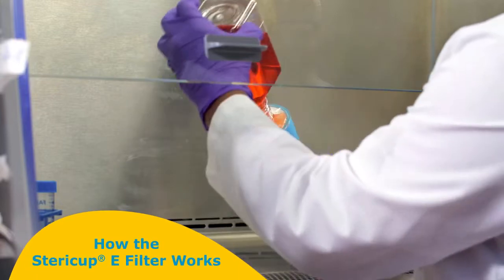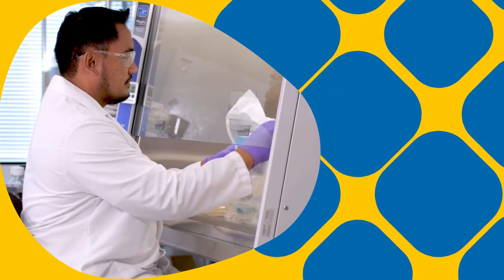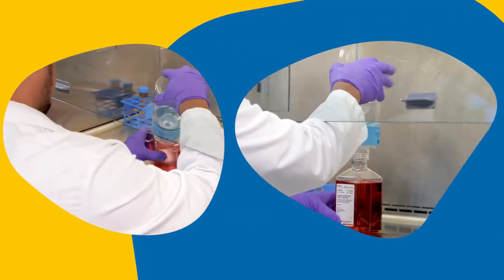Here's how the SteriCup E filter works. We started by remanufacturing the overwrap from recyclable plastic. The SteriCup E filter threads directly onto virtually any commercial media or buffer bottle.